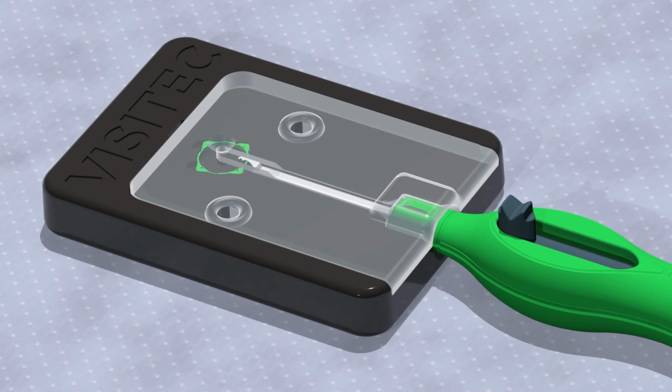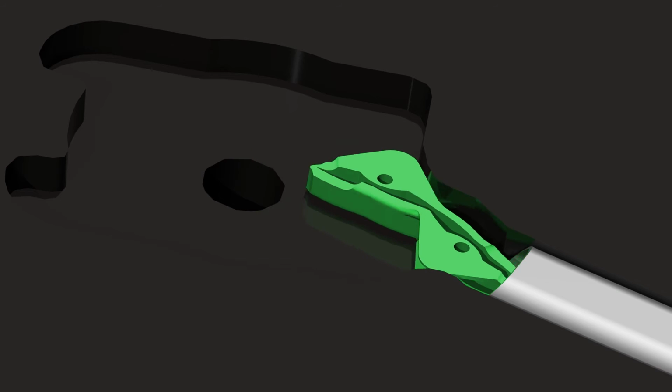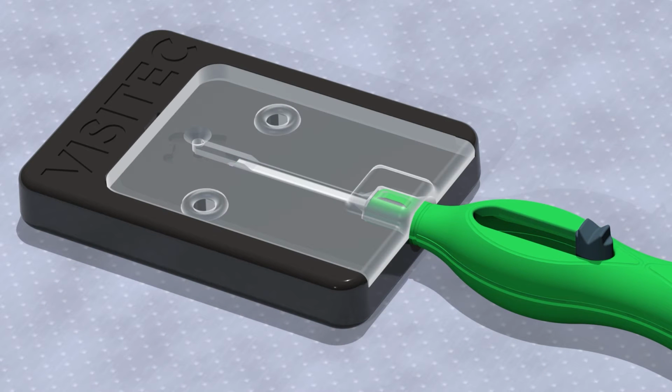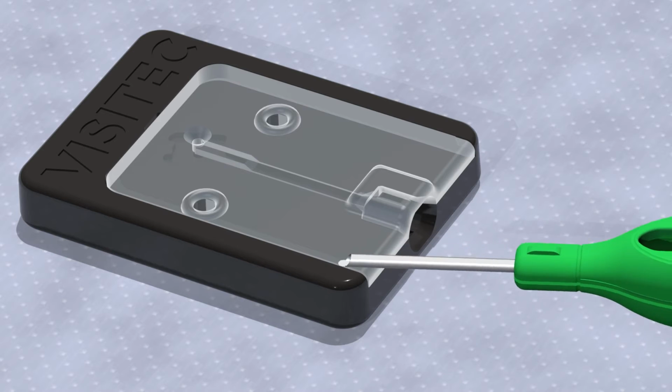Holding the nest with one hand and the inserter handle in the other, slowly retract the slider to load the ring into the cannula. Once loaded, remove the inserter from the nest, which should now be discarded.